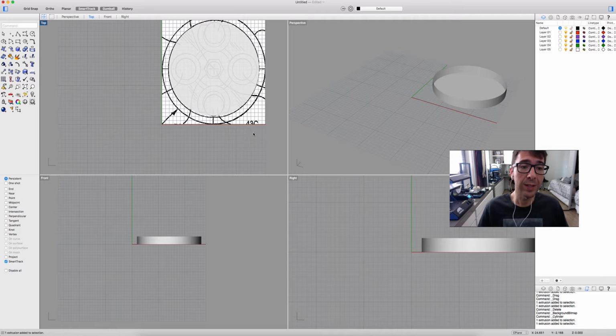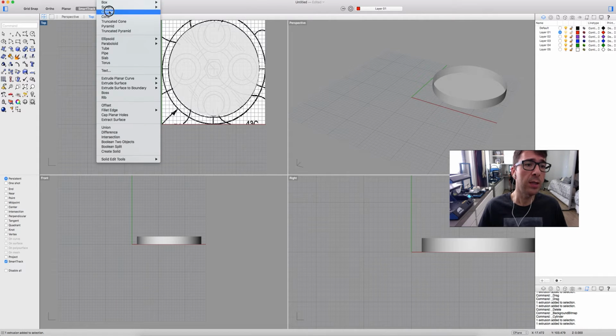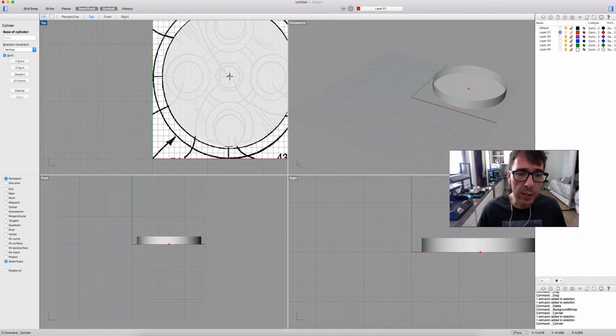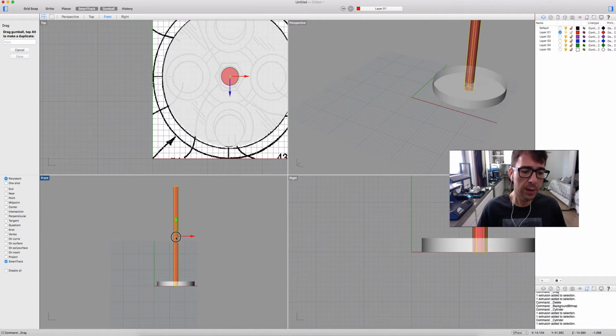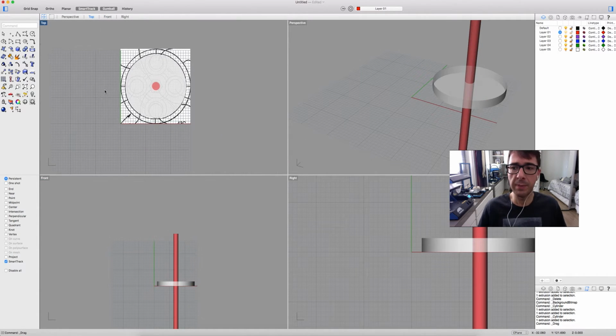Now we are going to design the central pin guide. I'm going to change colors. Let's design a solid cylinder, another cylinder in the center, just like that, and we're going to do a longer cylinder. Let's move it to the middle, and now we have the base plate and the central pin guide.